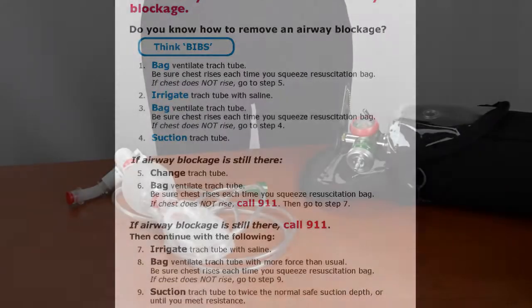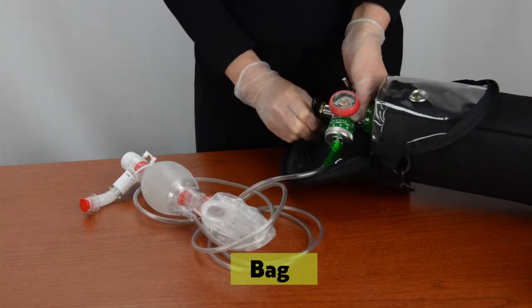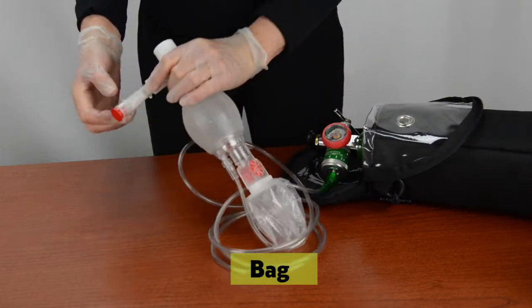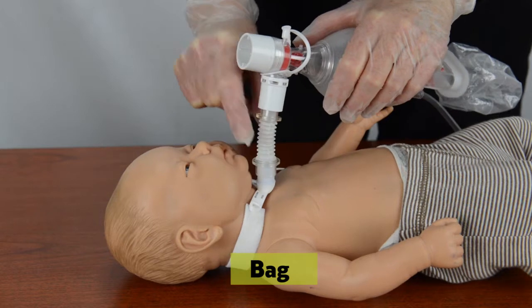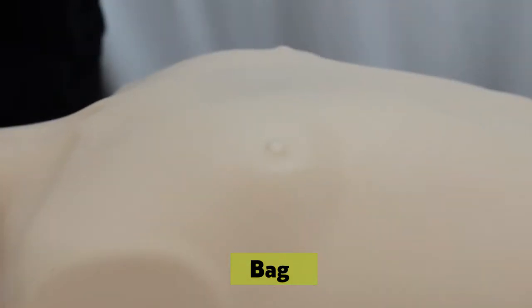B is for bag, which means use the resuscitation bag. Attach the resuscitation bag tubing to an oxygen tank and turn the oxygen on to the highest flow setting. Attach the resuscitation bag trach adapter to the trach tube and squeeze the bag firmly and repeatedly. Look at the patient's chest to see if it rises each time you squeeze the bag.